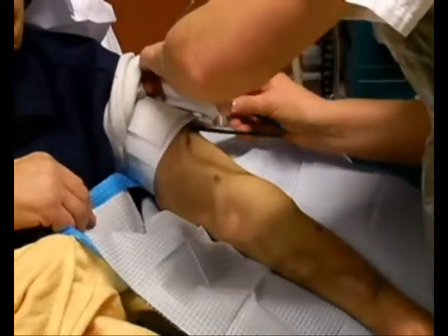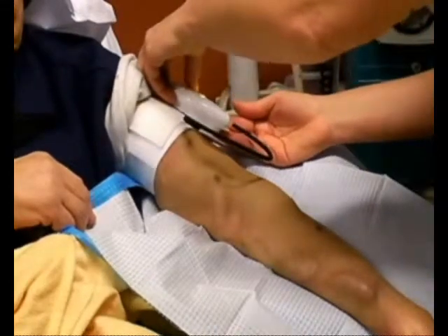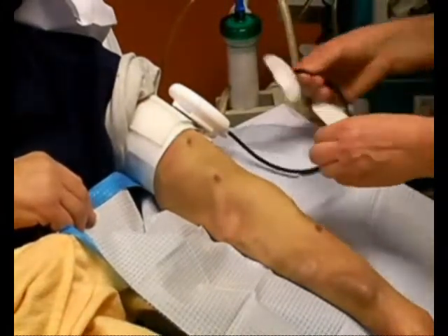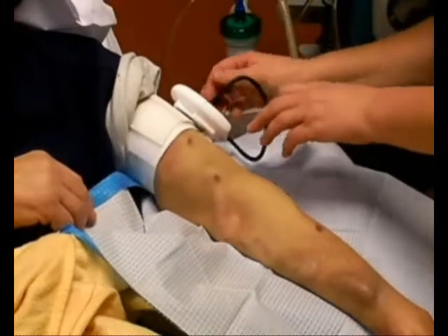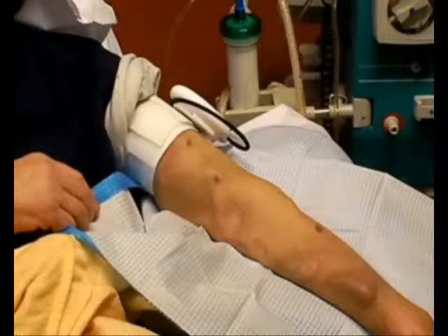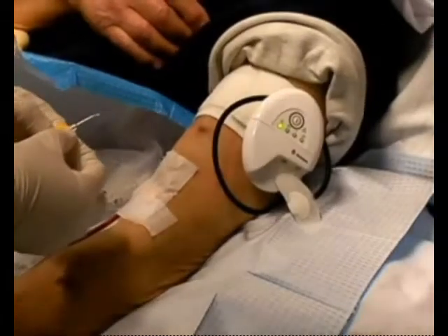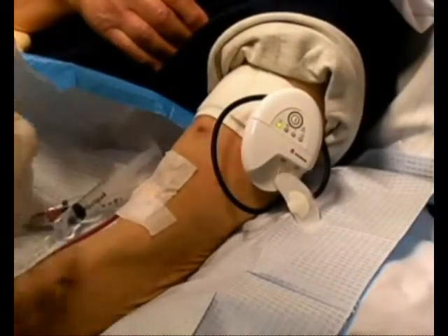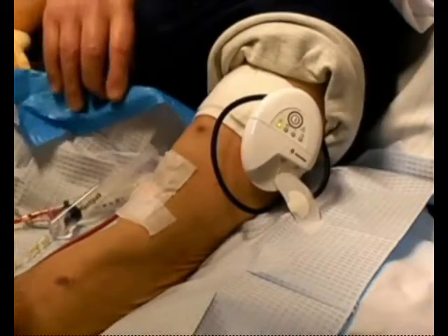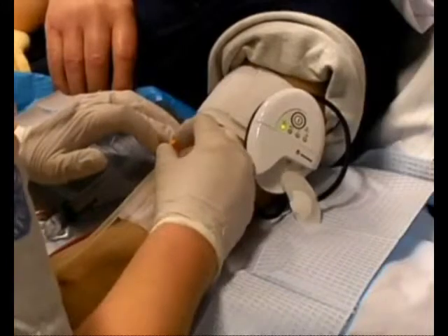The protective cover on the sensor patch can be removed prior to inserting the needles or after the needles have been inserted. Insert the needles as usual.